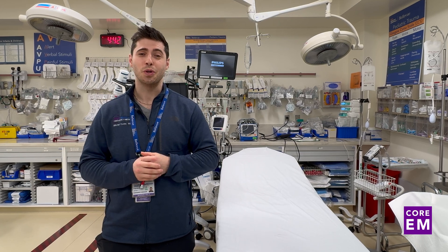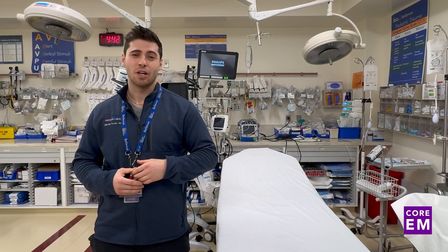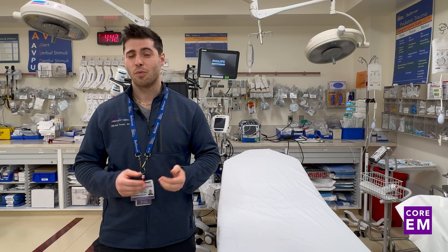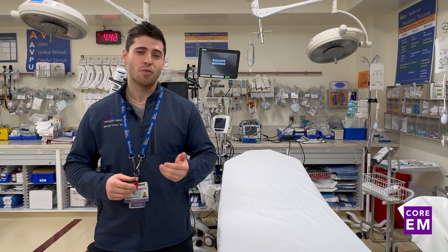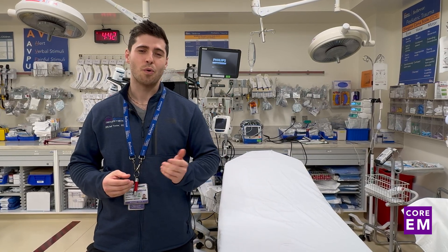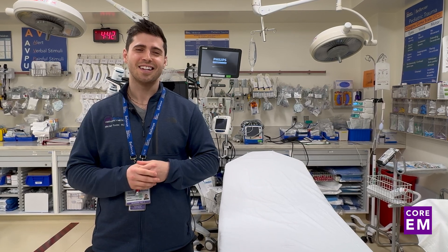So that's all folks. I hope you enjoyed this overview of the fascia iliaca block and that it helps you use it more with your patients who have these traumatic injuries — it can be very useful in providing significant pain relief while awaiting surgery. With all things, this takes practice, whether with your senior residents, attendings, or in the sim lab, and I hope it's something you'll continue to work on and master going forward.